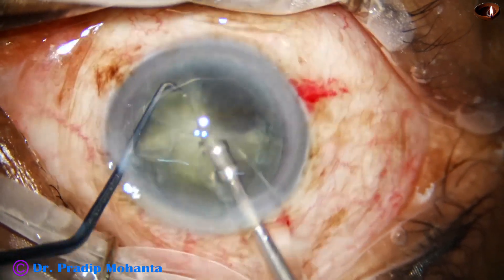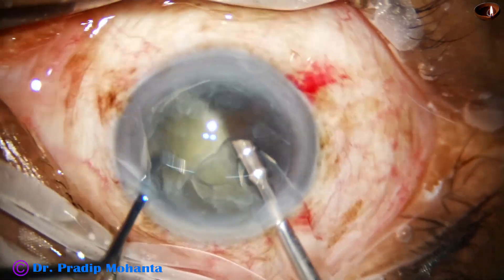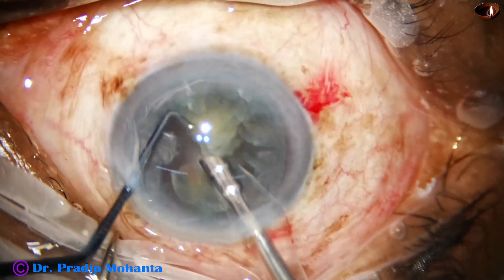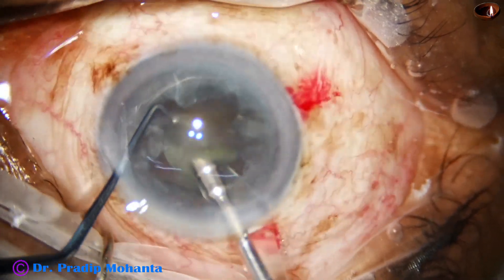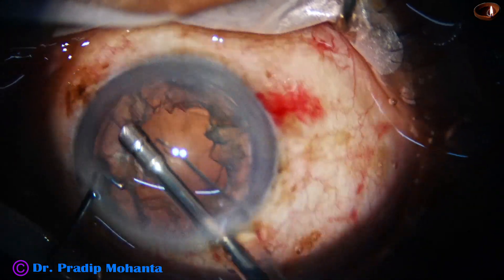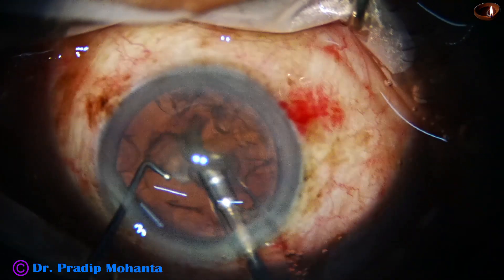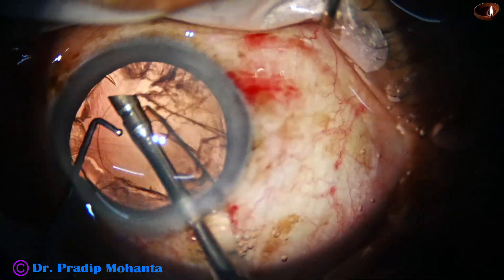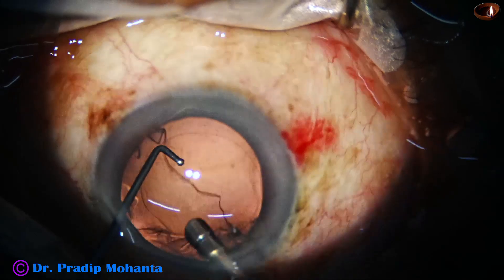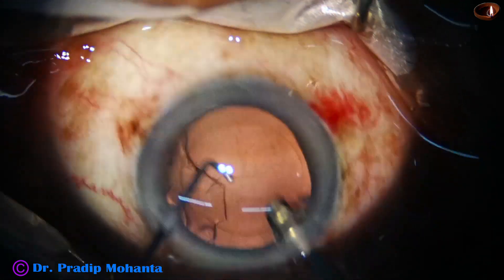And now we just have to go in and one by one we emulsify the pieces. This is a totally unedited real-time surgery. The four pieces are emulsified and now the epinuclear shell is removed with low vacuum and low flow rate, and then with irrigation-aspiration mode the cortical cleanup is done gently.